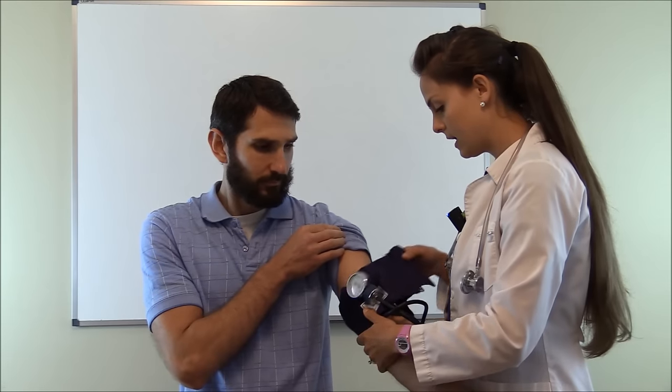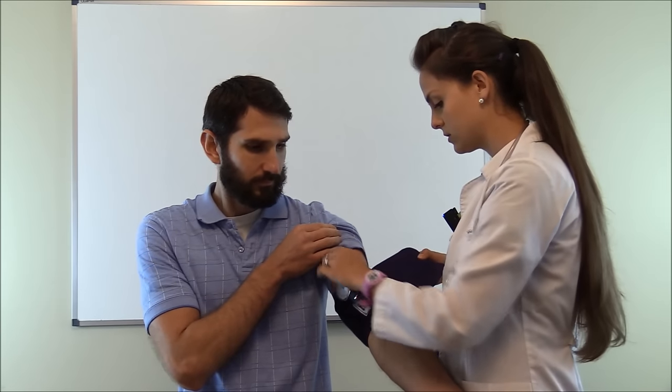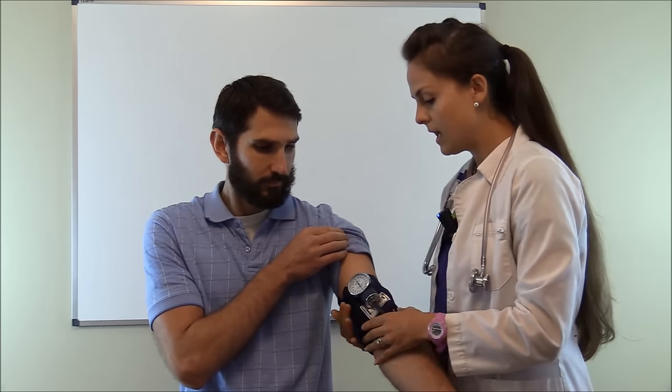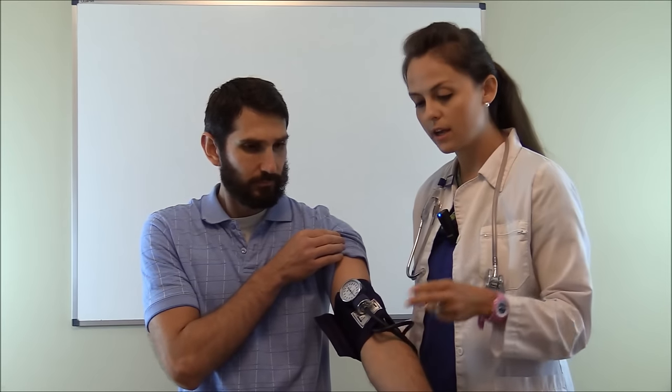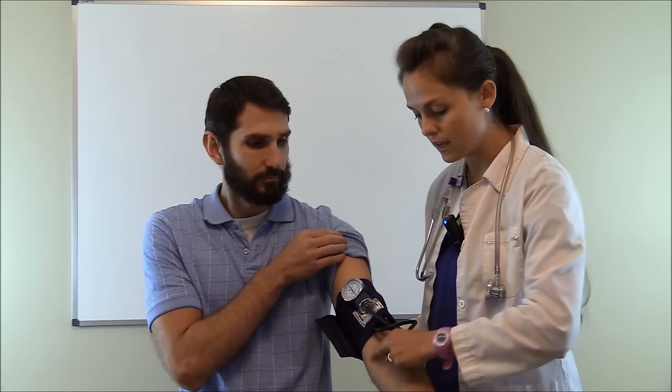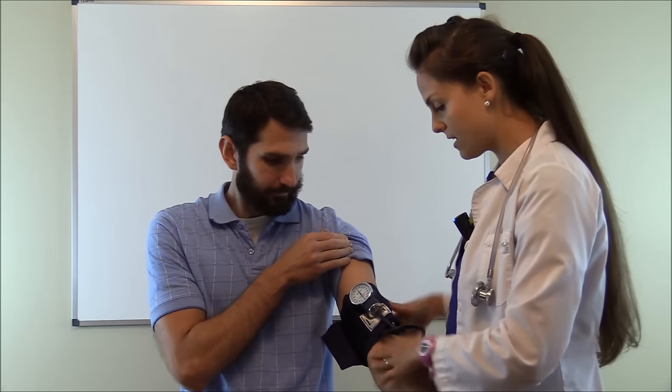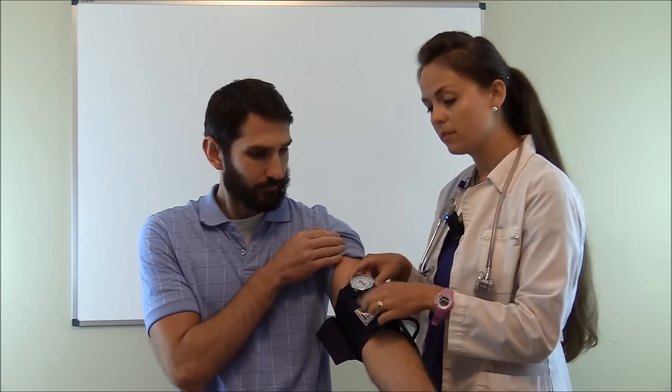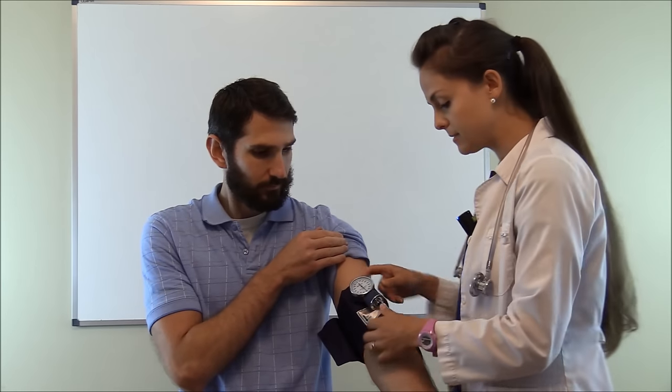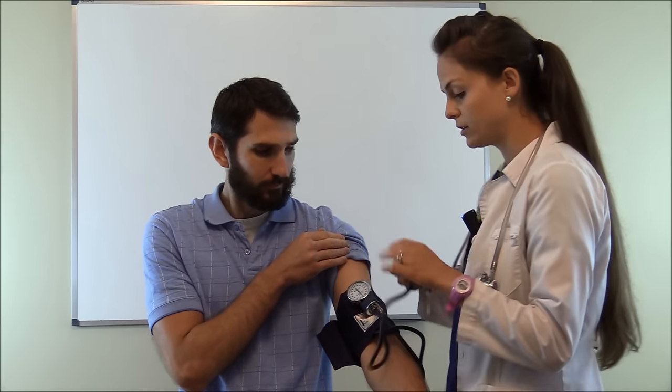I'm going to just put this on here snugly. To make sure you have the right blood pressure cuff take about two fingers and slide it underneath the cuff and make sure it fits snugly, not too tight not too loose, because if you don't fit it correctly you could get inaccurate blood pressures. Put your sphygmomanometer somewhere where you can see it because that is where you're going to be finding your blood pressure.